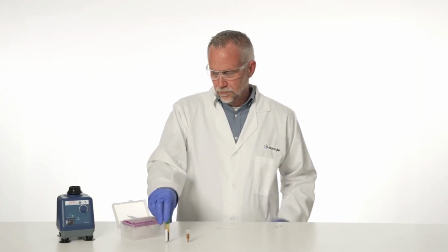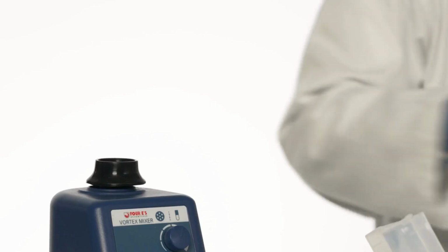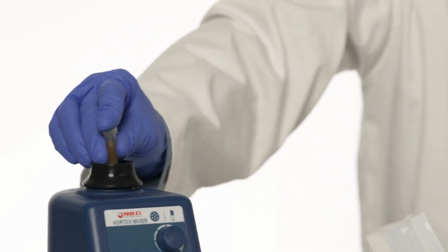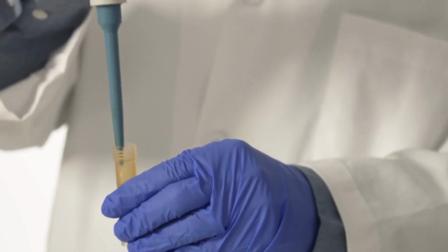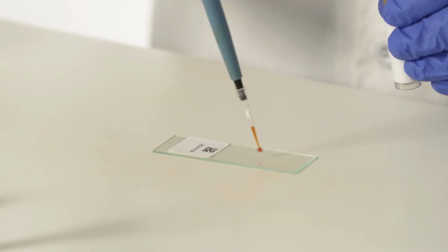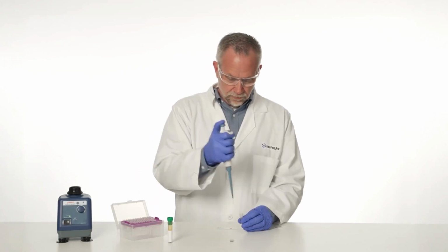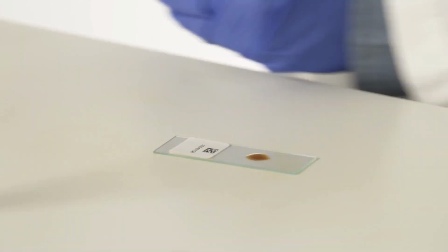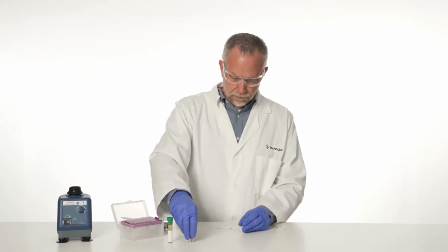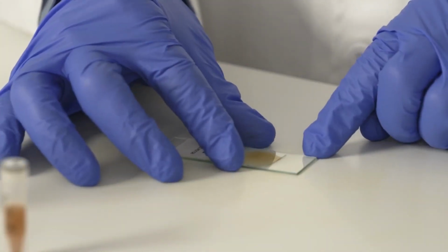The technician vortexes the mounting media and stool sample for 30 seconds to ensure homogeneity. Using a micropipette, they draw up 15 microliters of mounting media and carefully dispense it onto the slide. Using the same micropipette, they draw 15 microliters of the stool sample and mix it with the mounting media on the slide. They place a cover slip on the edge of the slide, positioning it so that the mounting media and stool mixture touch it before slowly lowering the cover slip down onto the slide.